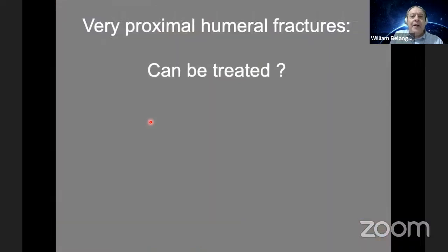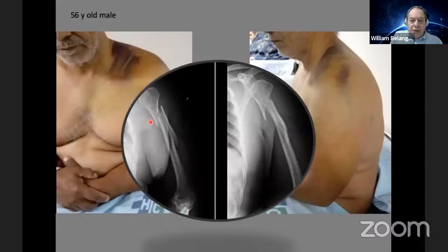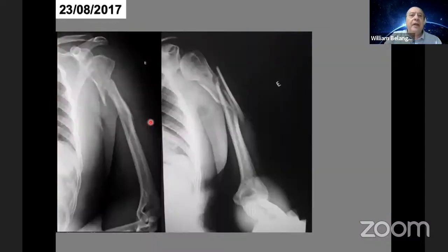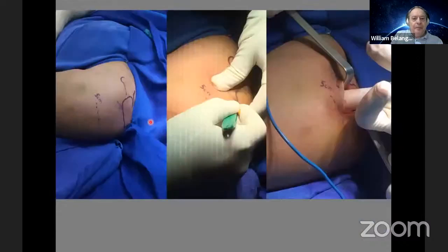Very nice. And can very proximal humeral fractures be treated? Yes. This is the patient. This is the fracture. You see here. In these cases, we usually use a Philos plate, a long Philos plate. We do a lateral approach, taking care with the axillary nerve. You identify the axillary nerve using the fingertip.